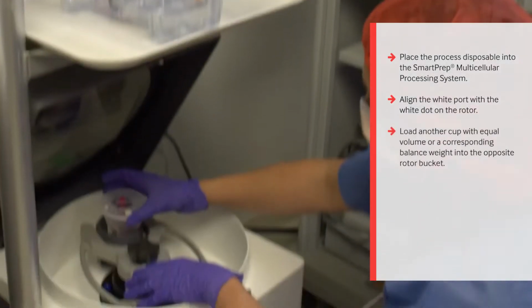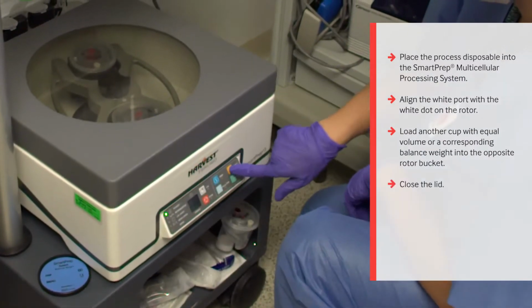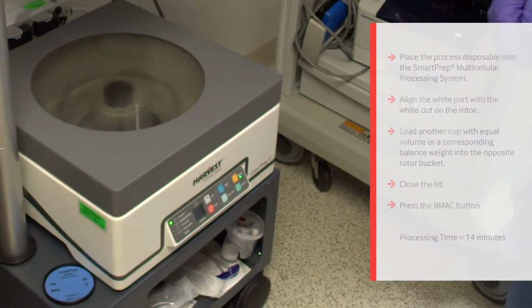Load another cup with equal volume or a corresponding balanced weight into the opposite rotor bucket. Close the lid and press the BMAC button. The total processing time is about 14 minutes.